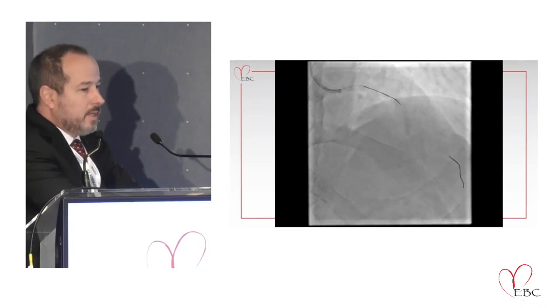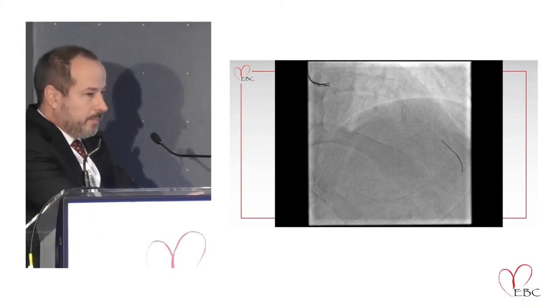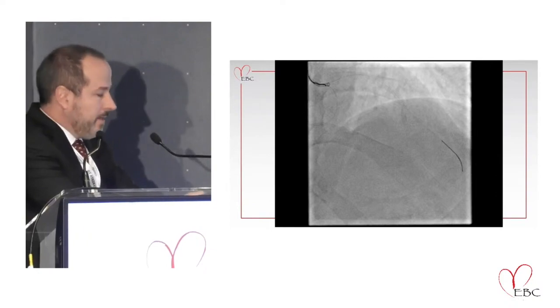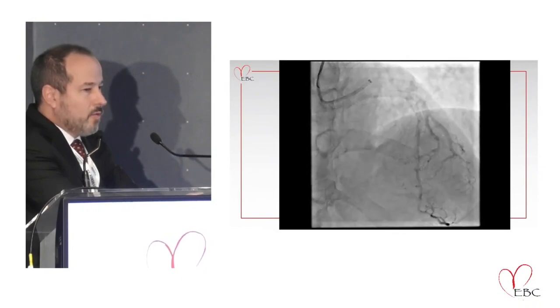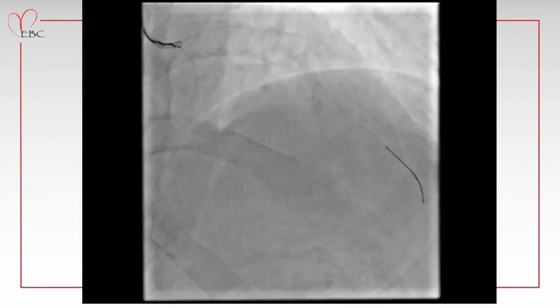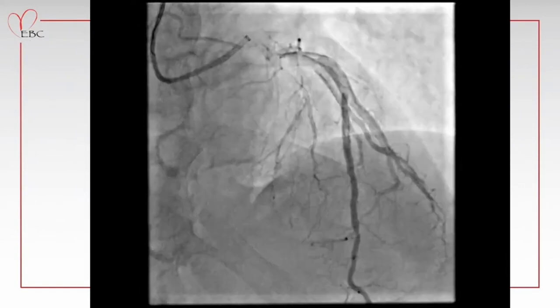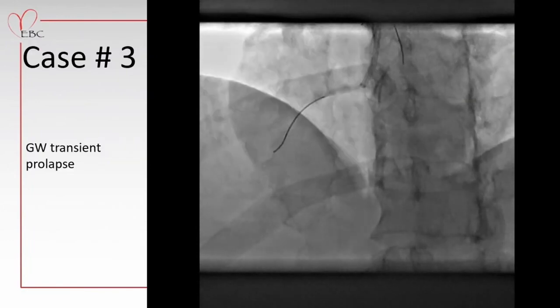This is another example. As you can see, the catheter tries to get sucked into the artery; however, the third floating wire prevents the catheter from going further into the artery. The final result shows that the left main is undamaged and the other parts of the artery are with no damage at all. From our experience, this technique has been shown to be safe.